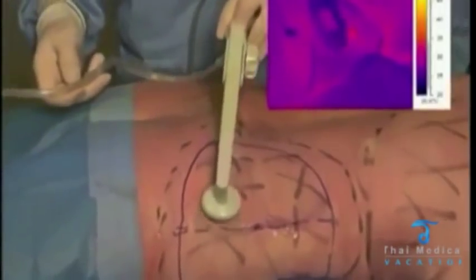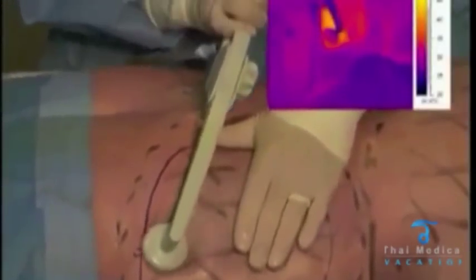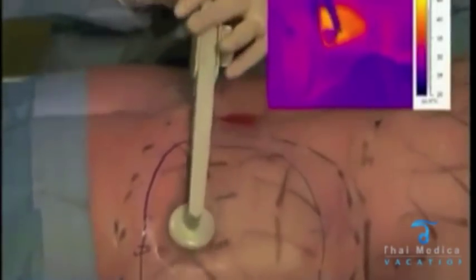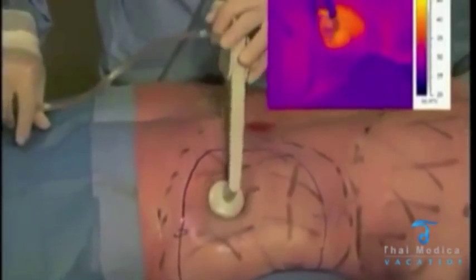You can see already we've got coagulated aspirate — no blood — a nice aspirate coming out while I'm doing the treatment. I'm maintaining my temperature and not wasting any time. You can see the nice liquefied fat leaving the aspiration zone while I'm heating the temperature in the hips.